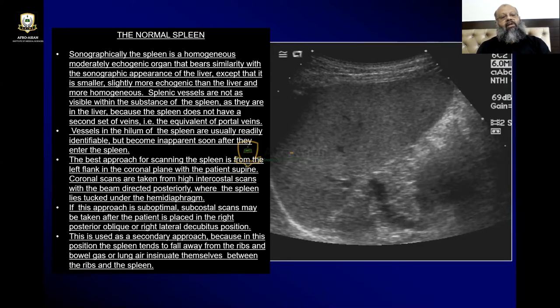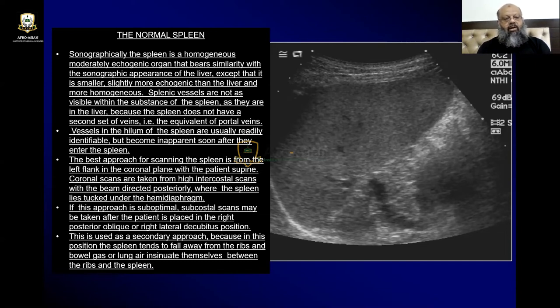Vessels in the hilum of the spleen are usually readily identifiable because there are not many — just the splenic artery and vein — but they become inapparent soon after they enter the spleen.